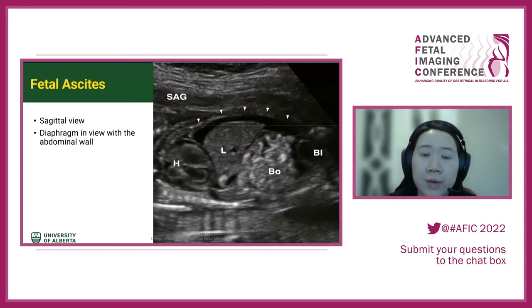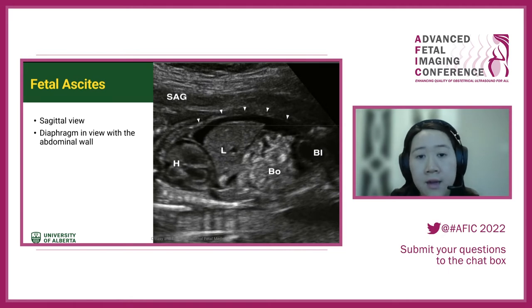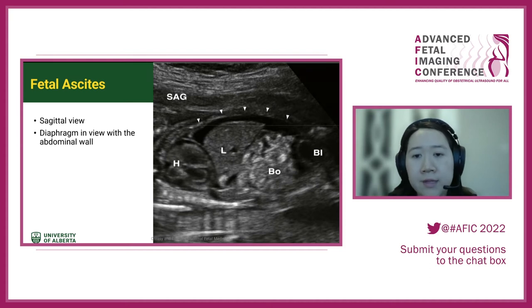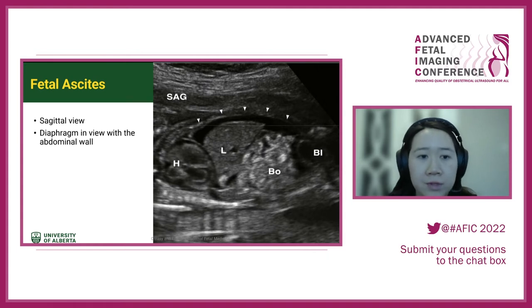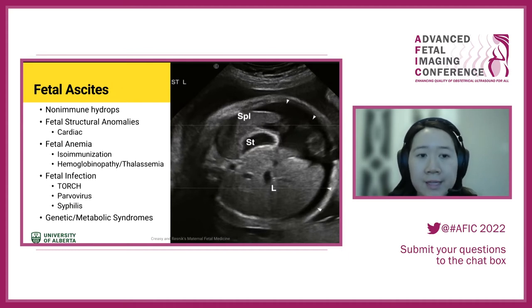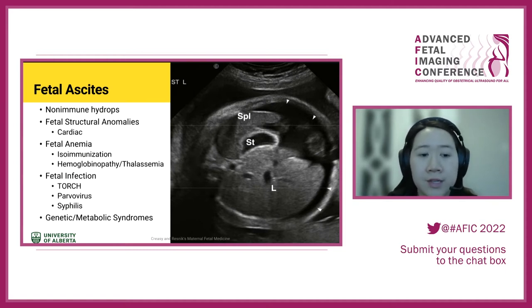We can also look at ascites through a sagittal view, examining the area under the diaphragm and around the liver. In this image, the heart is labeled 'H' on the left, the diaphragm separates it from the liver, and the arrowheads indicate that hypoechoic band around the liver. Timely assessment of fetal ascites is important to determine whether this is anemia, non-immune hydrops, a structural cardiac anomaly, or infection.